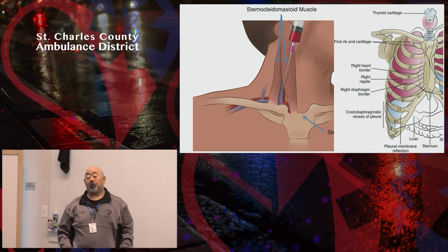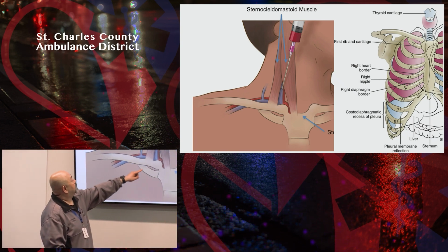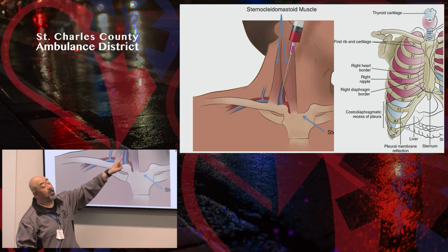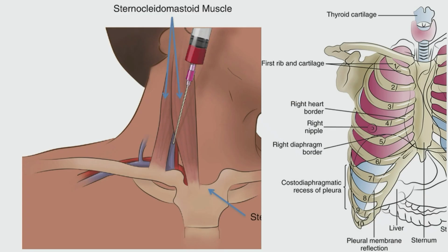The other thing to remind you is to look where the vessels are. Look how long that needle is. Can I convince you that if you happen to back wall that thing as you're placing it, you might hit an important structure behind it? I put this picture up there to give you a clue what structure I'm talking about. What am I talking about? The lung.